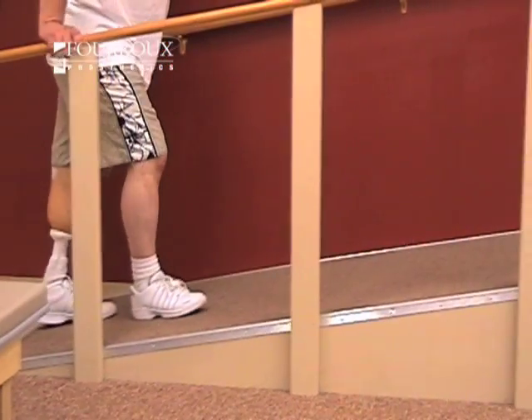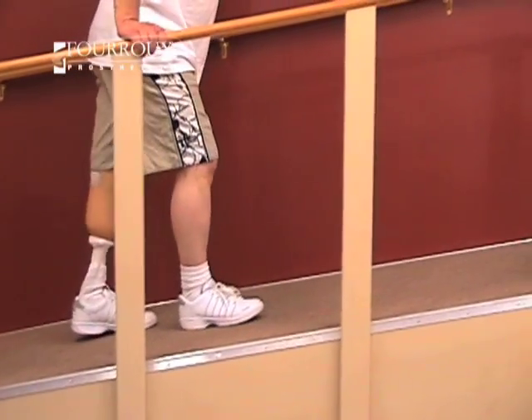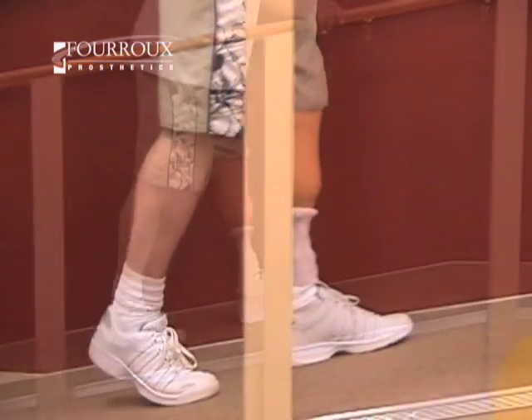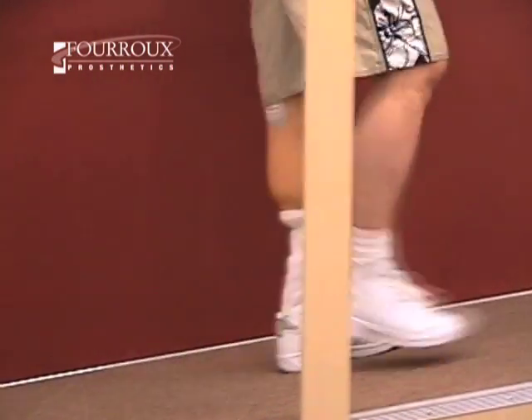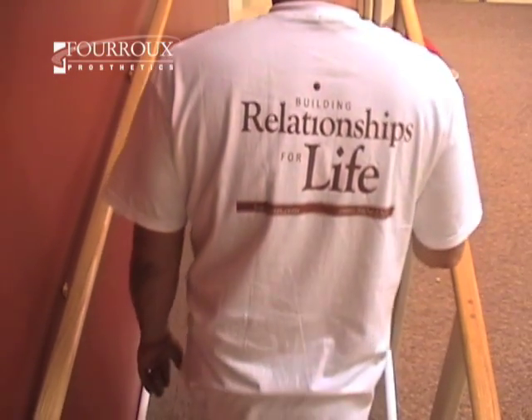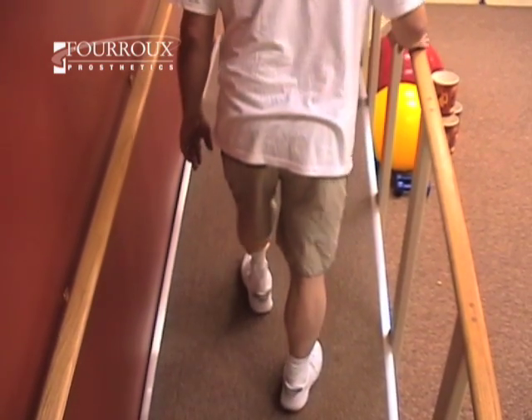Now practice walking up an incline. Again, control your residual limb while swinging your sound side to take a step. Avoid a quick extension of the residual limb knee. Smooth motion is the key. Use your arms for support if you need it. Allow your legs to strengthen. When walking up an incline, you may notice the toe of your prosthetic catching. Try not to let this happen, as it may cause you to trip.